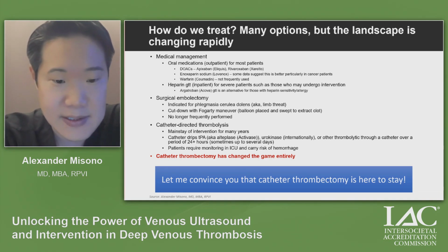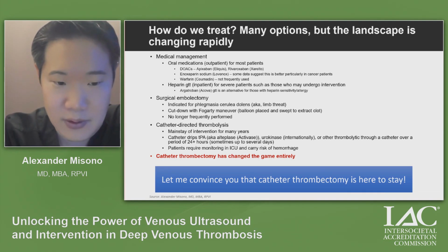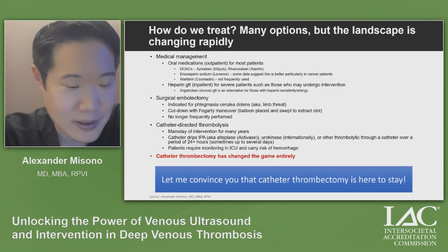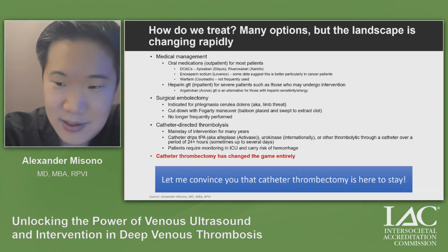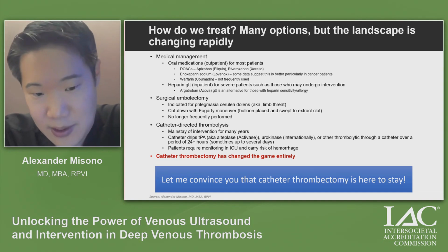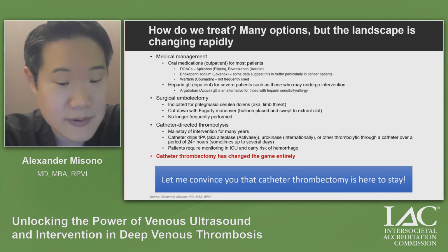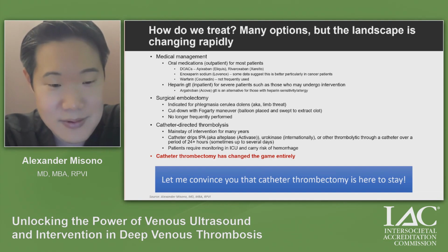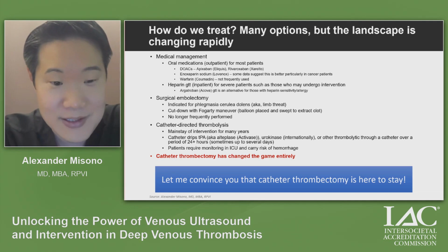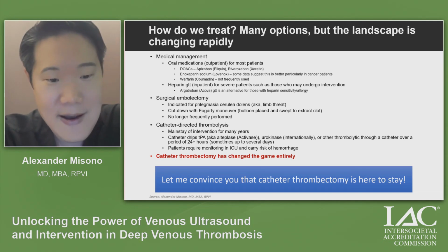These days, the things that people tend to do, not just in this country, but all over the world, I'm sitting in the USA right now, if there are any international people, but everywhere across the world, it's basically coming down to catheter-directed thrombolysis, a technique where we put a catheter into the vein and then drip thrombolytics for a period of sometimes hours to days, or sometimes I've heard weeks of this kind of therapy that people might do on and off to treat our patients.